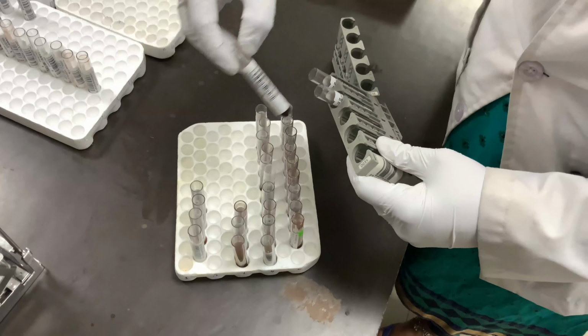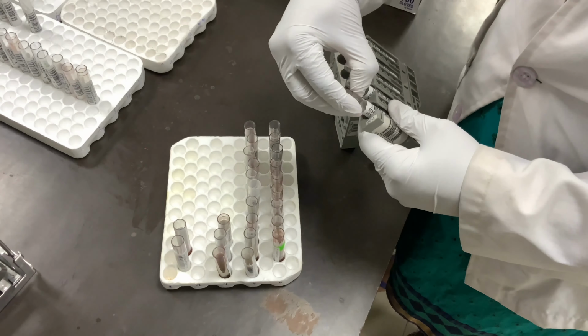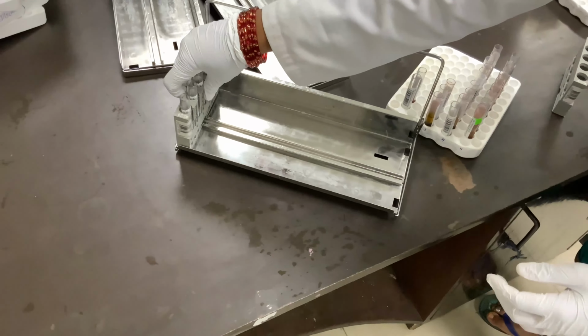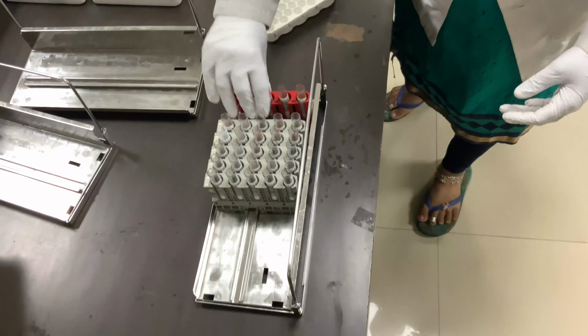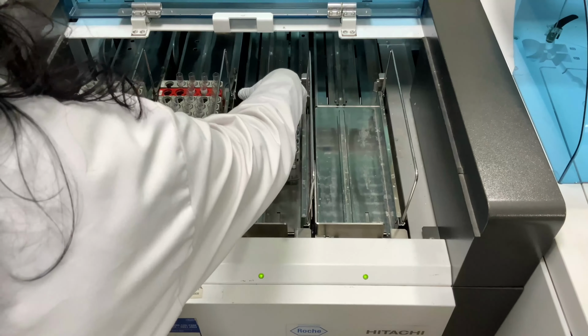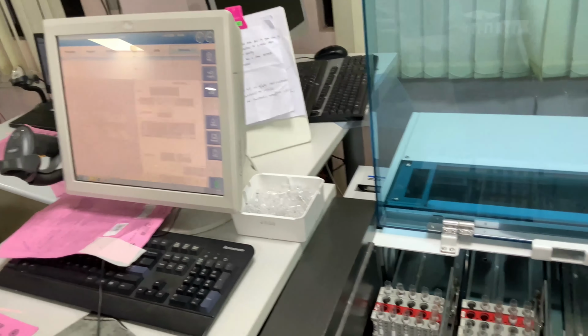In a fully automated auto analyzer, the samples are placed in the sample racks of the analyzer. They are placed in such a way that the barcode is clearly visible in the slit. And then the racks are placed into the auto analyzer and the machine is started.